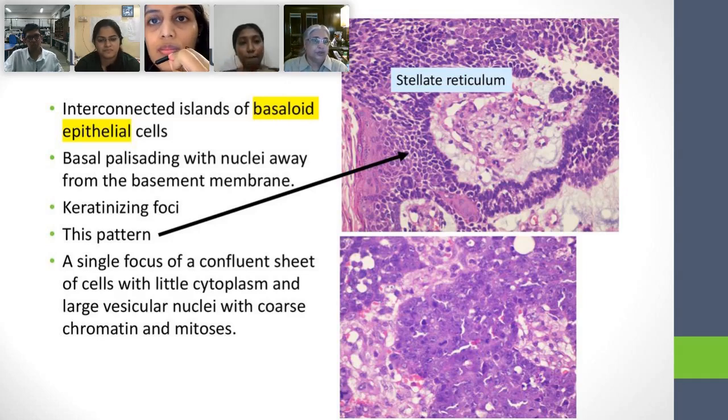Yes, ma'am. Do you agree? You don't have to agree just because she said so. No, I agree. That was what I thought. Okay. And Ashish? Yes, ma'am, because of the cytological atypia. So now how did this happen? You have a very benign looking ameloblastoma, and you have a very high grade area. What is the word that you will use?